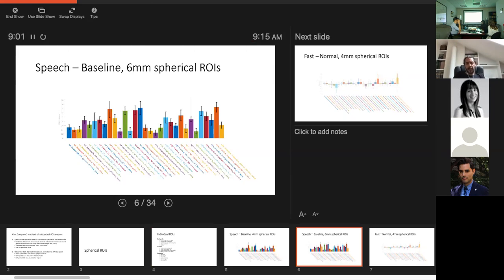But on the other hand, 8 millimeter is kind of the preferred value for correcting across subjects. Smoothing is not only to increase the signal-to-noise ratio, it's to correct for potential differences in the exact location of the thing that you care about across subjects. A 12 millimeter ROI diameter is already relatively large, so probably 4 millimeter smoothing would be fine. But in general, 8 millimeter smoothing I like. I don't think we will see a huge difference.